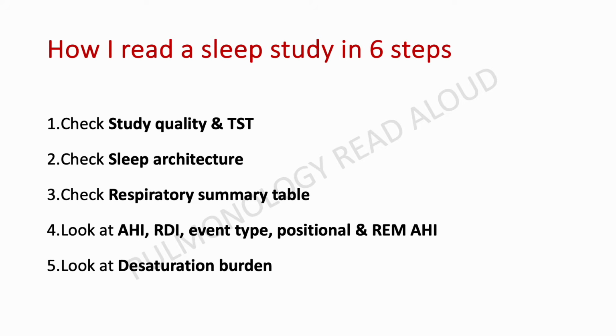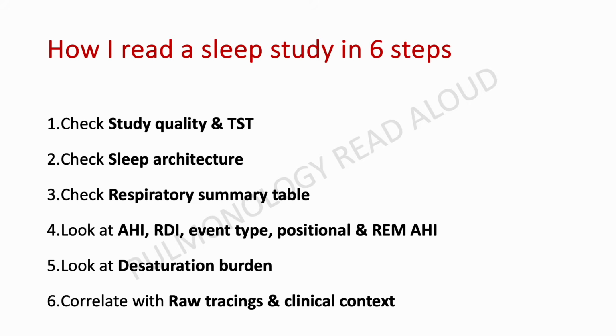There's more and more data and studies pointing at how oxygen saturation, or rather the level of desaturation, is a very important factor to understand the overall morbidity and mortality of patients. So the desaturation burden is something that we have to really be concentrating on.